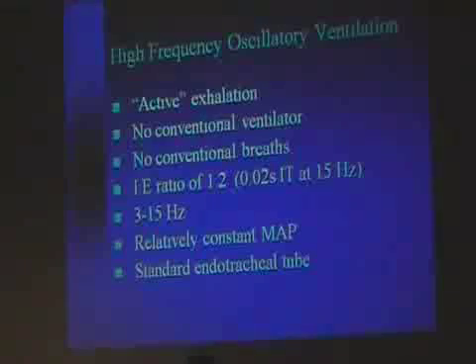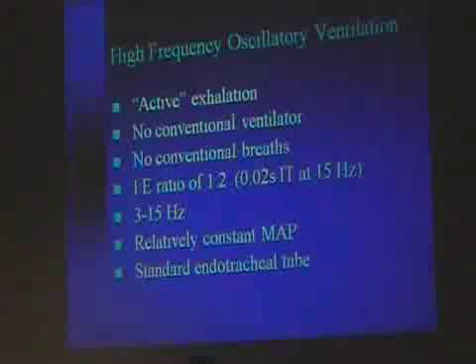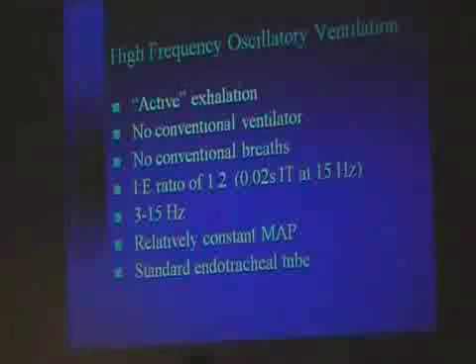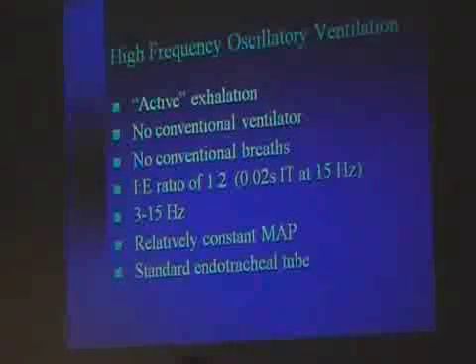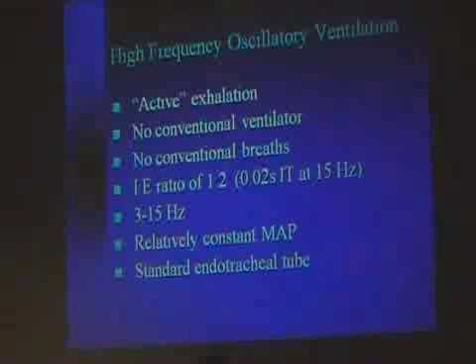The patent on the Sensormedics is about to expire, and there is another ventilator, the Draeger, that is putting forth an oscillator, and Marty Kessler and me and some others may be looking at this ventilator in the near future to see if it's at least as good as the Sensormedics. It does not, however, use the conventional ventilator as part of the oscillator. It's a ventilator that can do both. All right? And so stay tuned for that. We'll see what the future may bring.